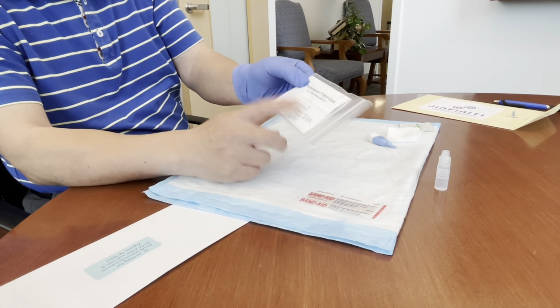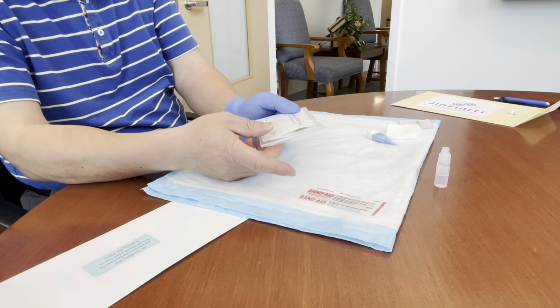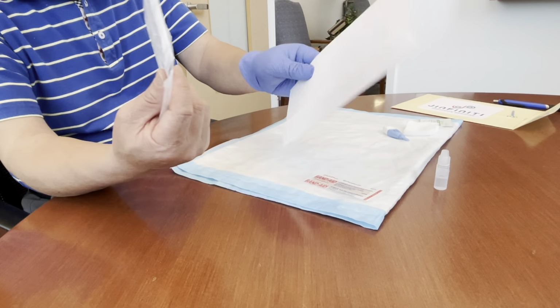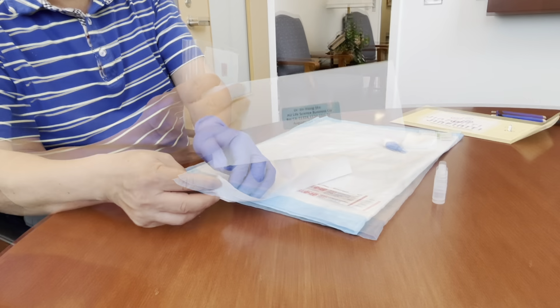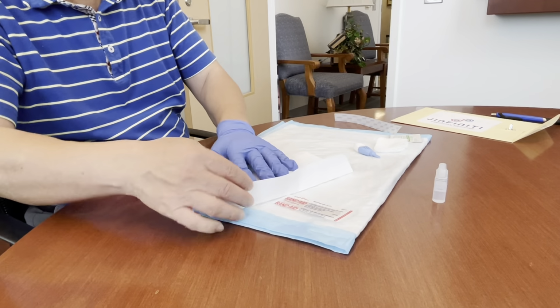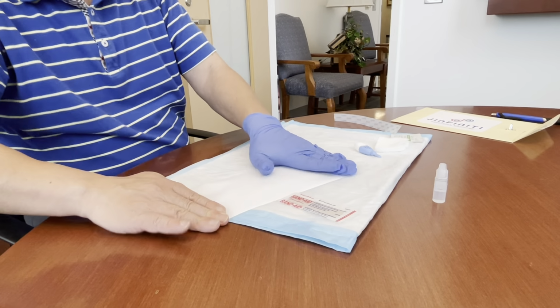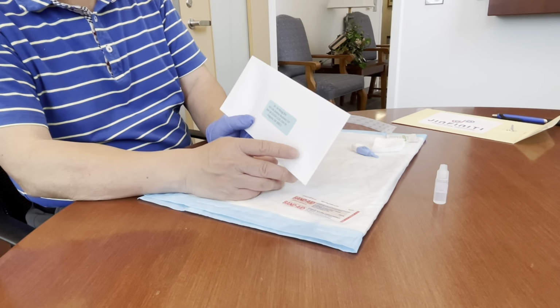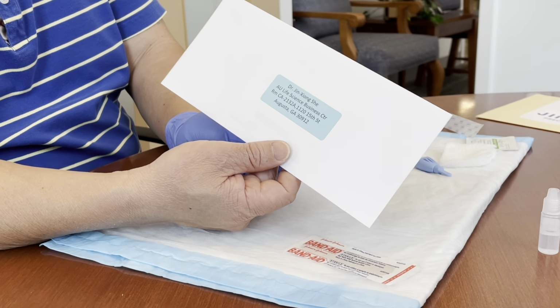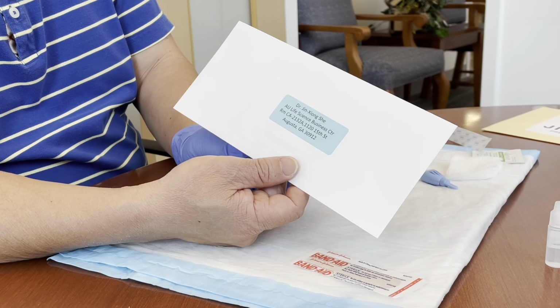Ensure that you have written your name and the date on the filter paper card. Then add the sealed bag to the return envelope. Remove the backing strip to expose the adhesive and seal the envelope. Please add adequate postage stamps to the envelope to send it back to the lab from your location.